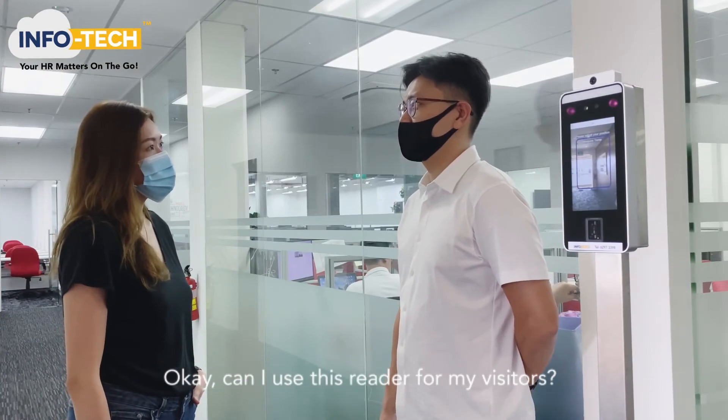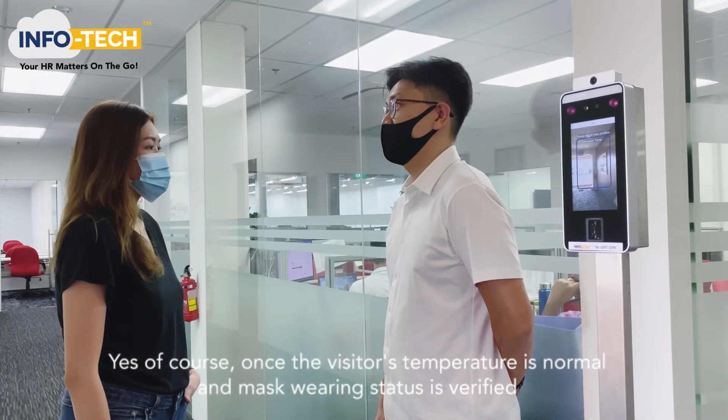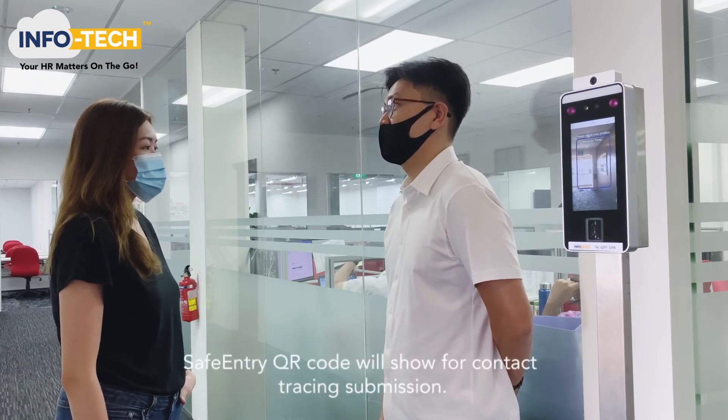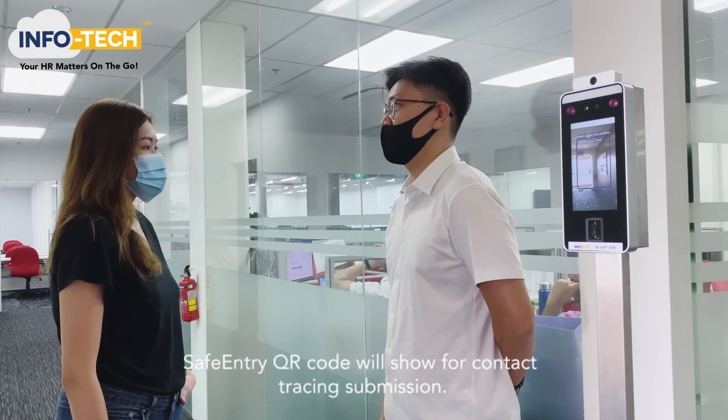Can I use this reader for my visitors? Yes, of course. Once the visitor's temperature is normal and mask wearing status is verified, a safe entry code will show for contact tracing submission.